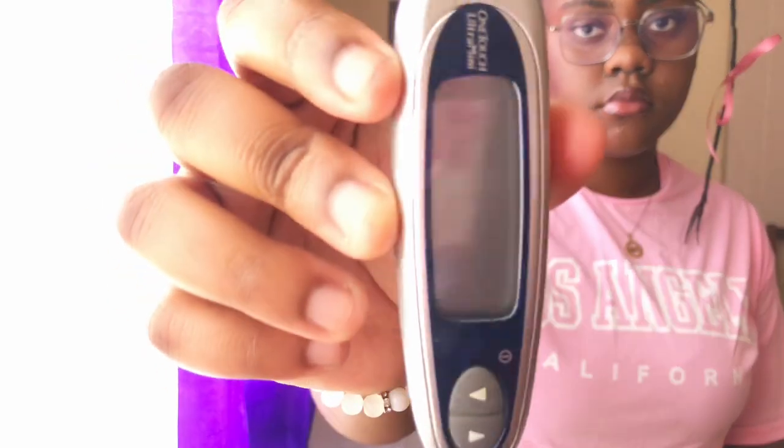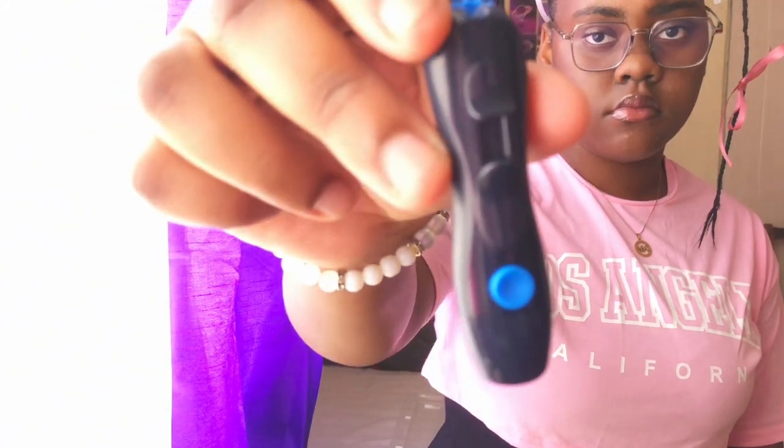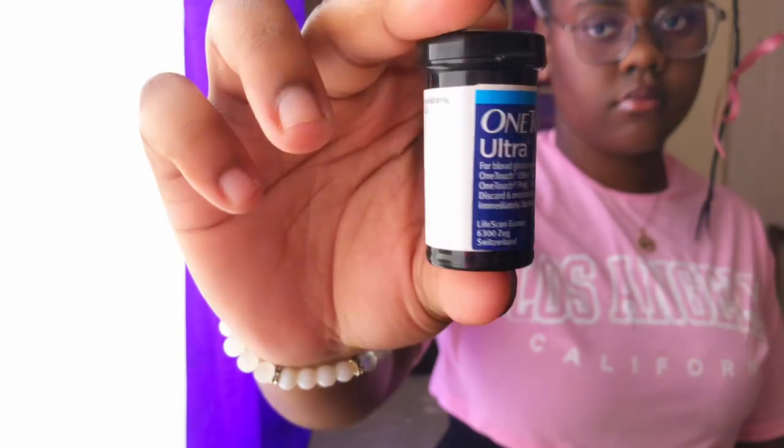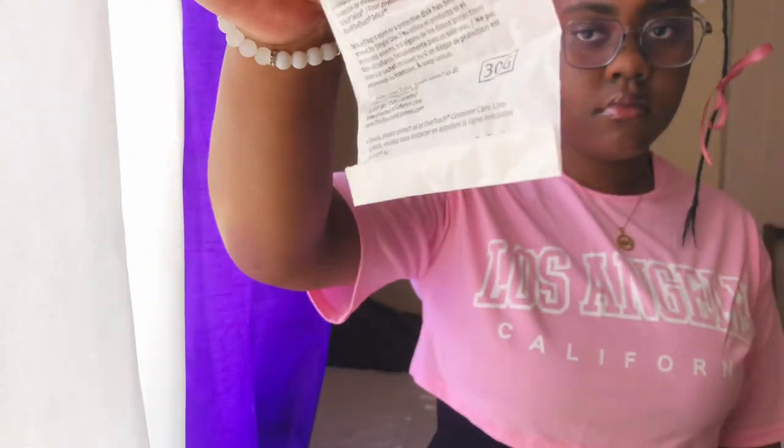The next item is the blood sugar or blood glucose machine. It is used to track your blood sugar level during day and night time — you need to know when it rises or falls so you know what to do: either bring it back up or bring it down. You have your blood glucose meter, the lancet device, test strips, and the lancets, which hold the needles to put inside the lancet device.